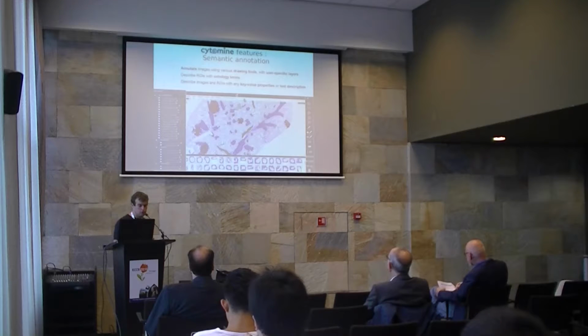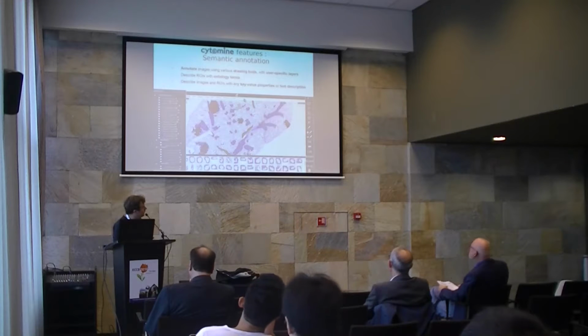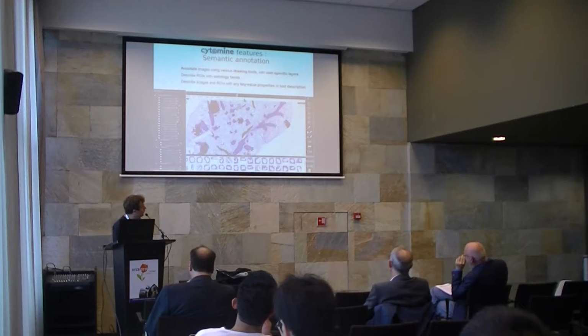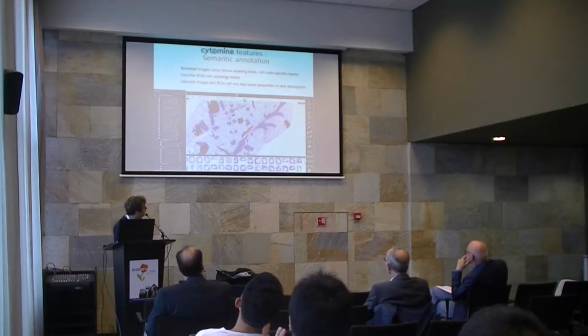Okay, so it's not only about visualization, of course, it's also about annotation of these images. So we have implemented different drawing tools. So directly in the web interface, the pathologists, the biomedical researcher can draw first manually different types of geometrical objects. So you see here that I have annotated some tumors, some bronchus, etc. So you have here examples of all the bronchus that I have annotated in the images. And to each of these objects, to each of these annotations, they can assign different types of information.